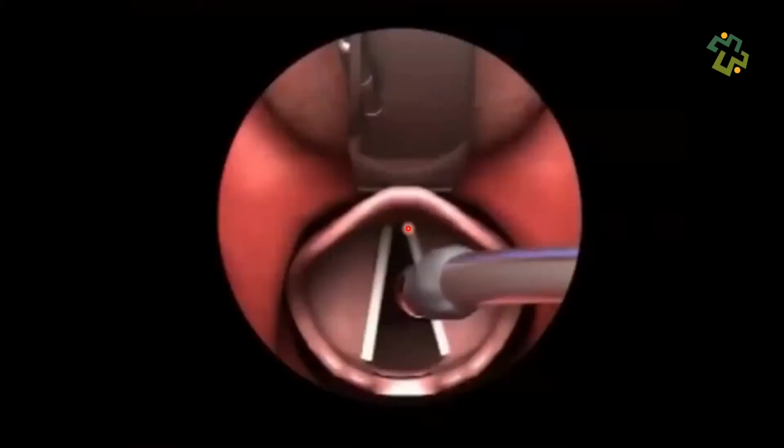Yeah, there's lots of illustrations in the talk, illustrating proper technique when intubating patients, what to do, what not to do. This is just a visual representation of what you should be viewing when you're intubating between those vocal cords, okay?